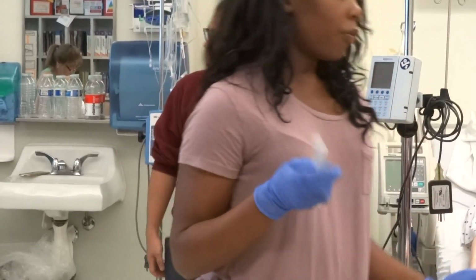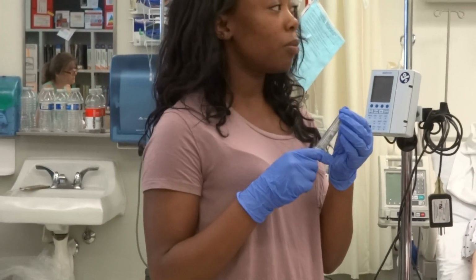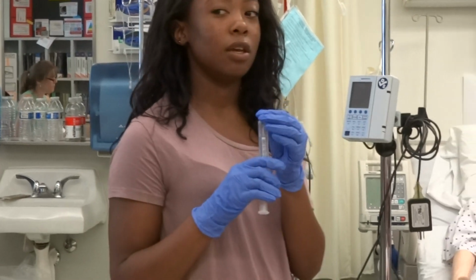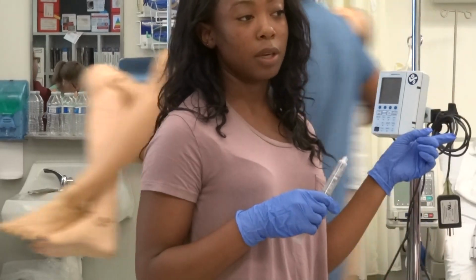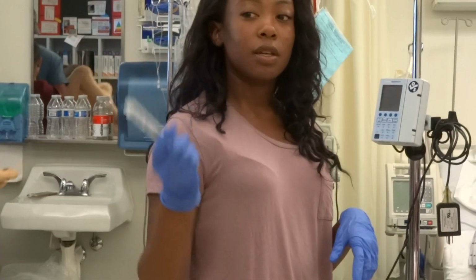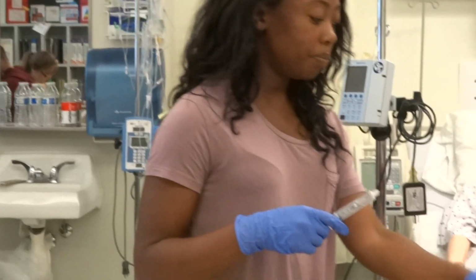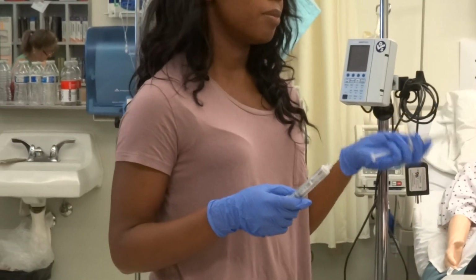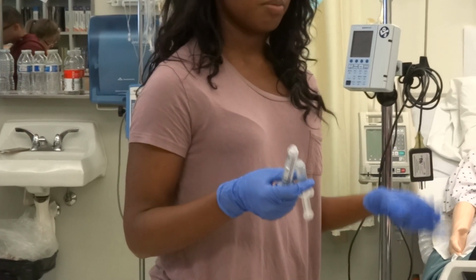Before you leave the med room, I know that we're giving it IV push, but we're not taking the needle off, because the needle is actually gonna come off in the patient's room before you give the medication. So when I'm taking this medication to the room, the needle is still attached. And again, I can grab a 5 mL syringe this time since I'm pushing normal saline too, and I can grab alcohol swabs.